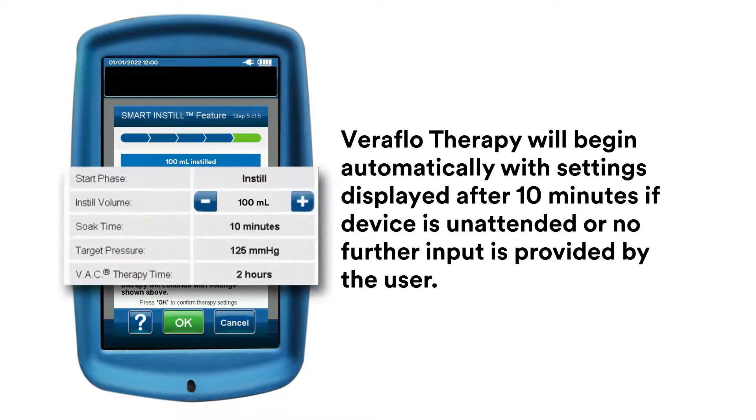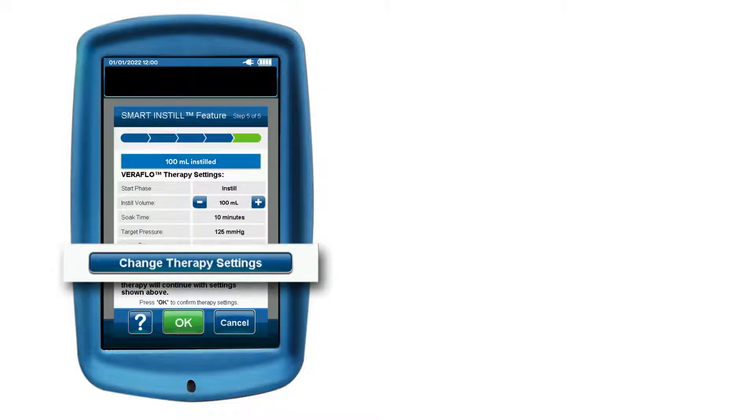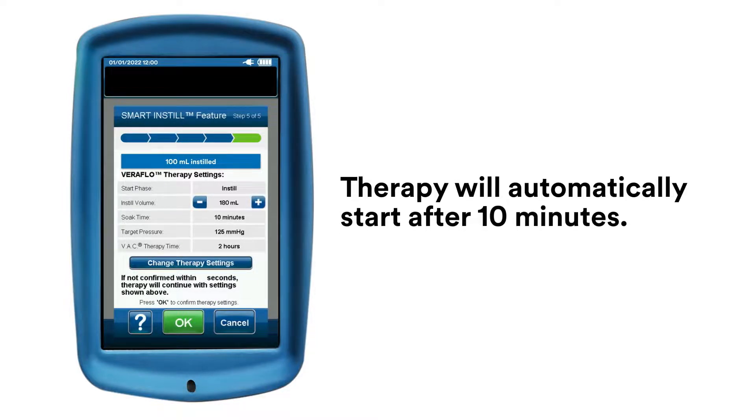Here, you can easily adjust the estimated fill volume by pressing the plus or minus buttons. If necessary, you can adjust other parameters of VeriFlow Therapy by using the Change Therapy Settings button. Once satisfied, select OK to begin VeriFlow Therapy, or if no action is taken, therapy will automatically start after 10 minutes.